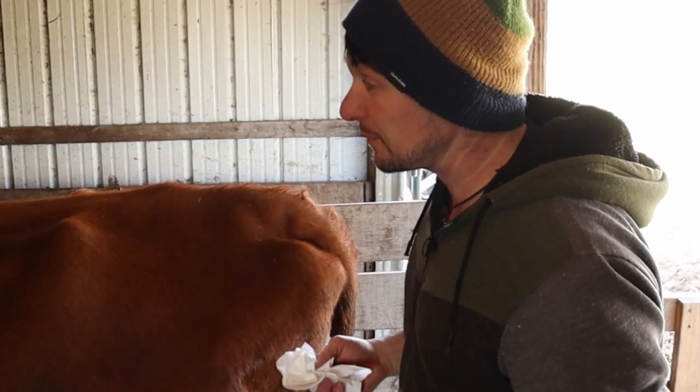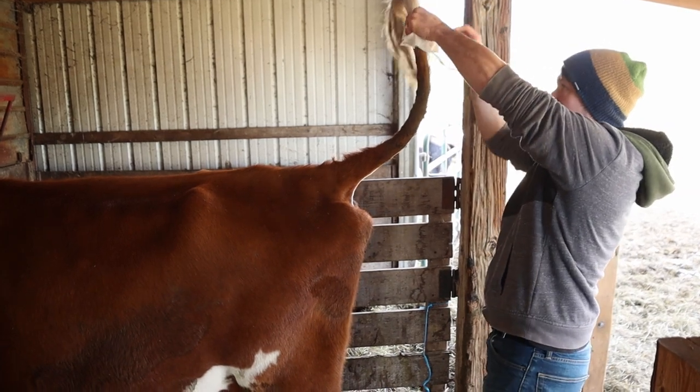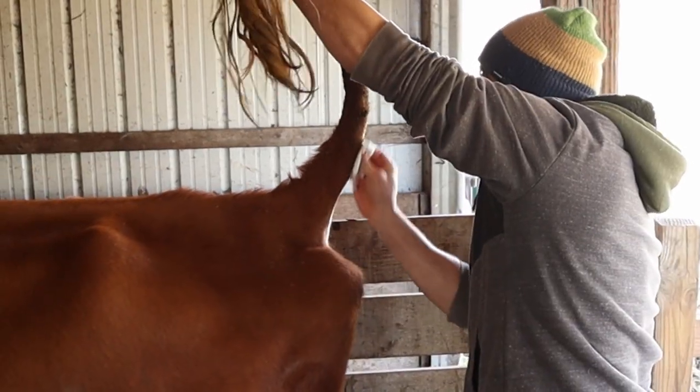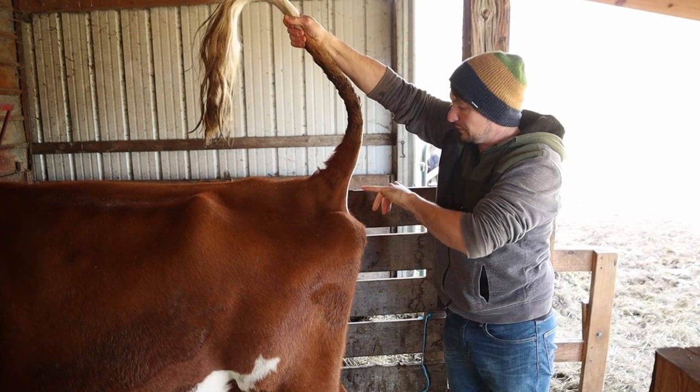It would be handy to have two people for this, but I don't this time. You lift her tail up pretty much as straight as possible — that's how you get the blood out, and it also kind of immobilizes her. Now that it's clean, we're going to go about six inches or so above her bunghole.